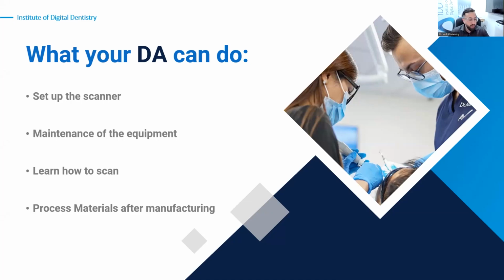Let's say a patient loses their retainer and you're booked up for the whole day. Let's say you have two DAs, or you have a spare one, or you can tell your DA while you're doing some sort of treatment, they can go into another room and quickly take a scan. There's a lot of things that become very beneficial when you train your DA. The other thing which we'll talk about is in-house manufacturing. Our DAs are very highly trained, and they are trained to process a lot of the materials after we've made them in-house. And that becomes a key factor in printing and milling.